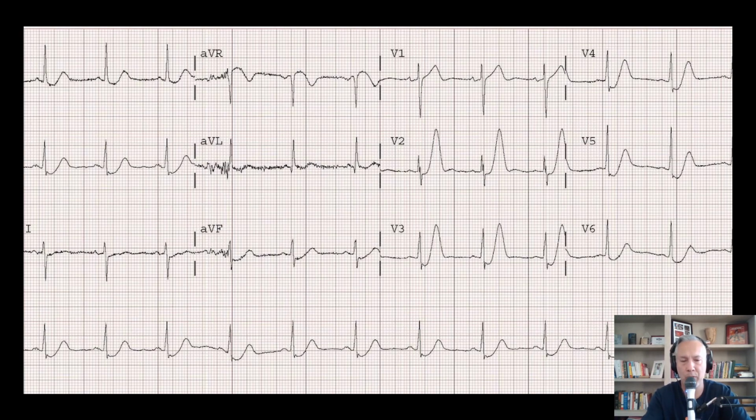Here's another example. These are actually called De Winter's T waves. So you have a little bit of ST segment depression, and then it slopes into this tall, symmetrical T wave. V2, V3, V4. I want you to think occlusion. If you look over here too in lead 2 and lead 1, you have some depression as well.